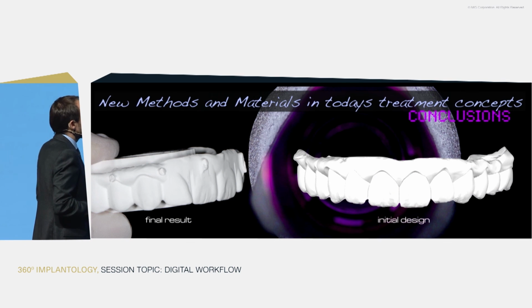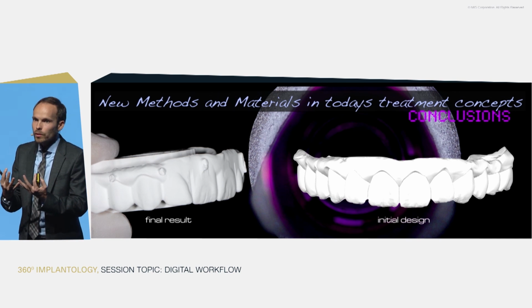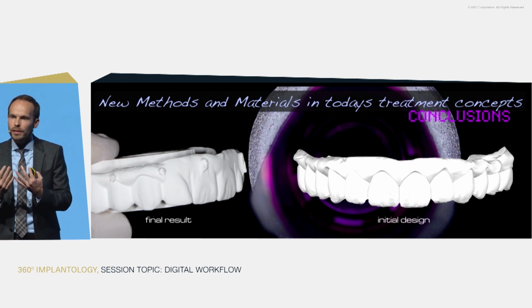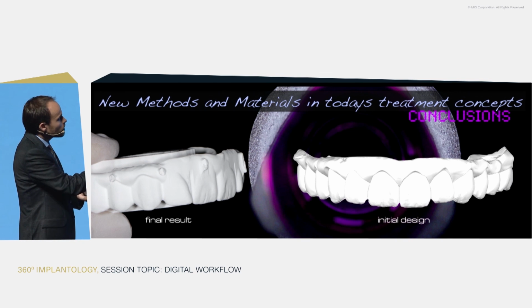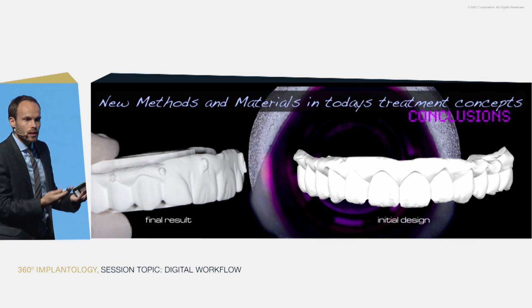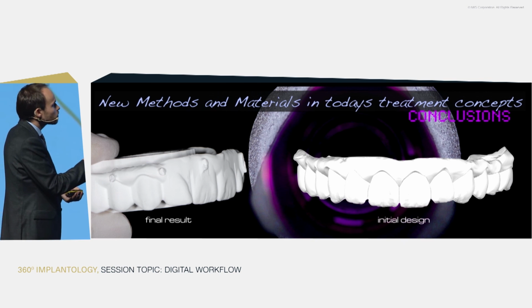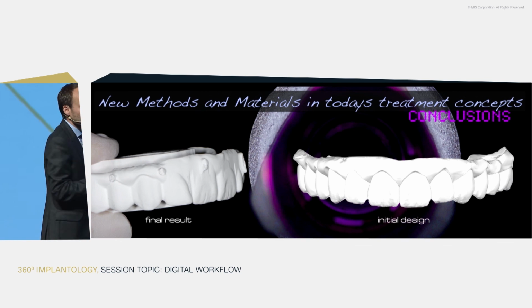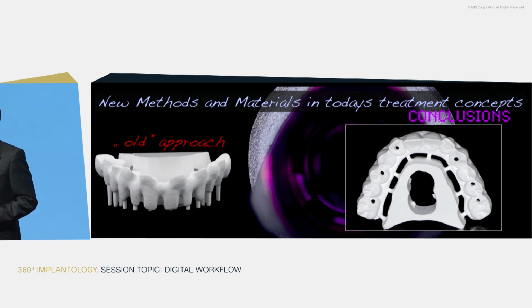But you see this problem also now looking into the monolithic reconstructions. You see them on the buccal aspect, because the machines are just not able to mill all these beautifully designed aspects here that you can see if you compare these 2 data. It should be the same. Unfortunately, it's not so far. So here we are struggling. It's maybe something that will be solved in the future, but all the beautiful approximal areas here, I have to redefine myself with time.